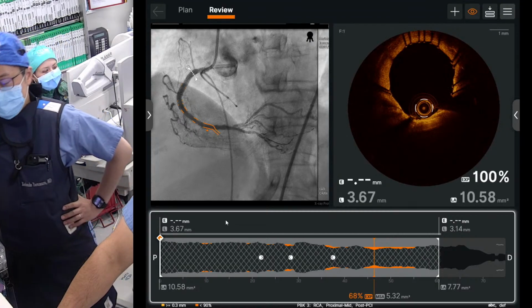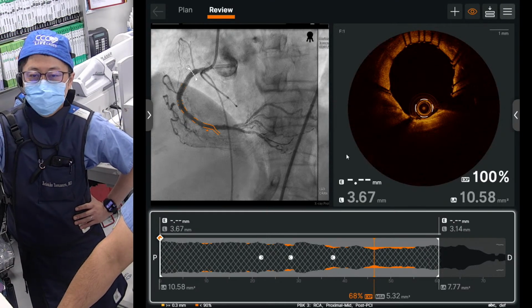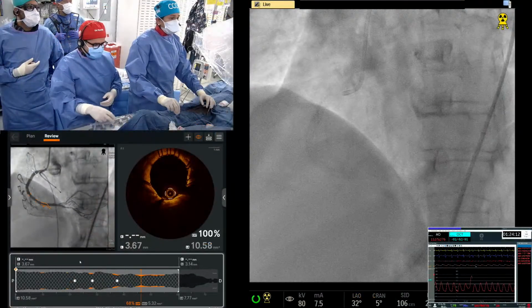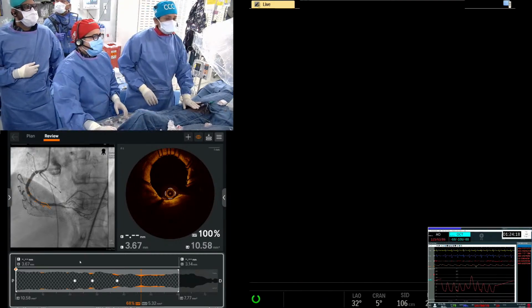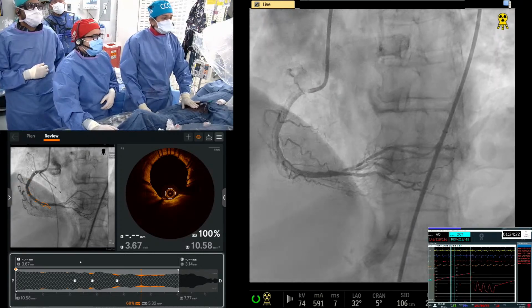I think we leave it. I think we did a great job. Yeah, I agree. Let's be happy with our work. Is everybody happy? We do one final picture, right? And then I show some final slides, right? Ready? Look at that. Nice.